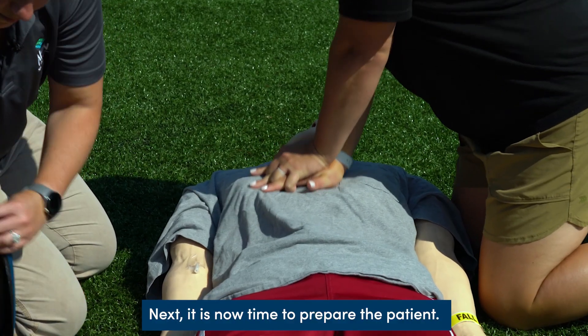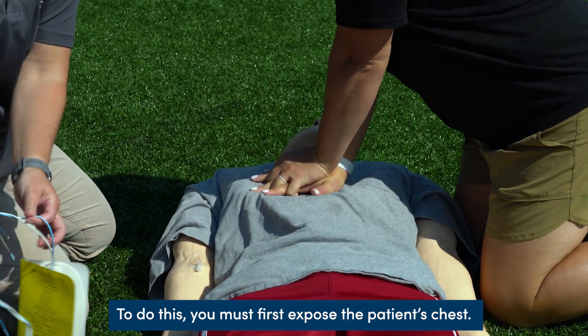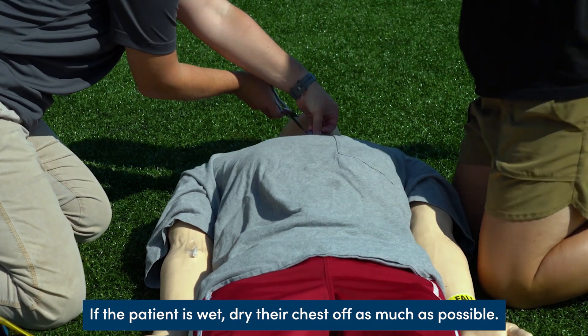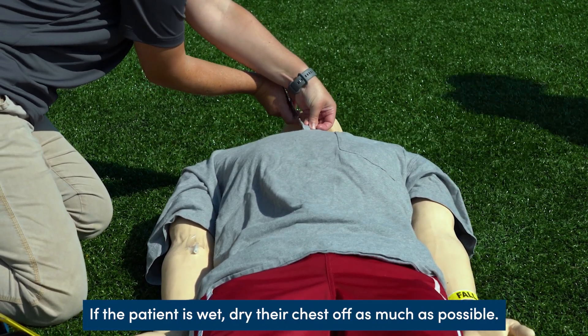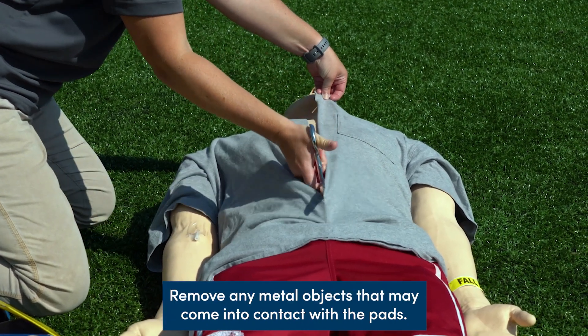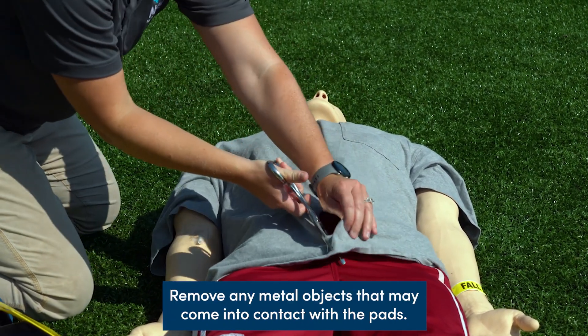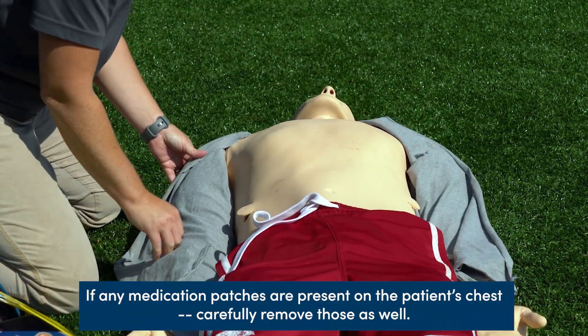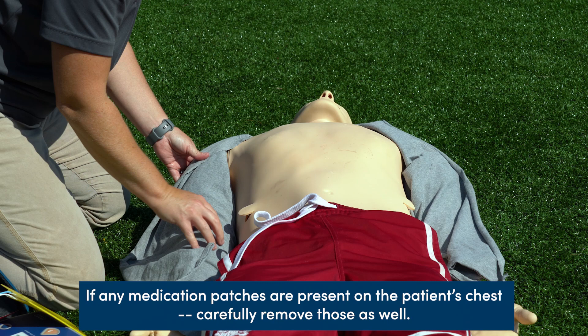Next, it is time to prepare the patient. To do this, you must first expose the patient's chest. If the patient is wet, dry their chest off as much as possible. Remove any metal objects that may come into contact with the pads — this includes underwire bras. If any medication patches are present on the patient's chest, carefully remove those as well.